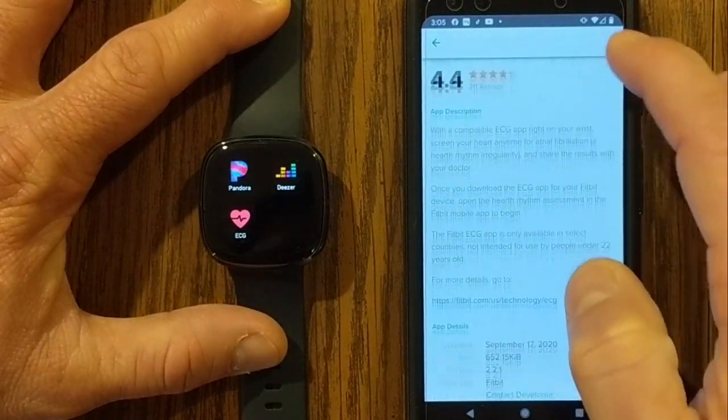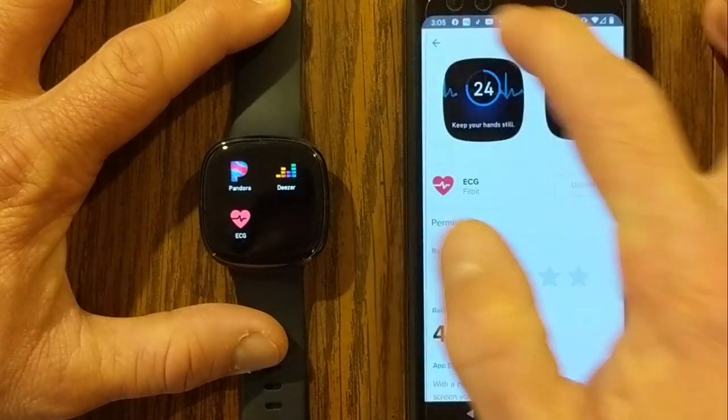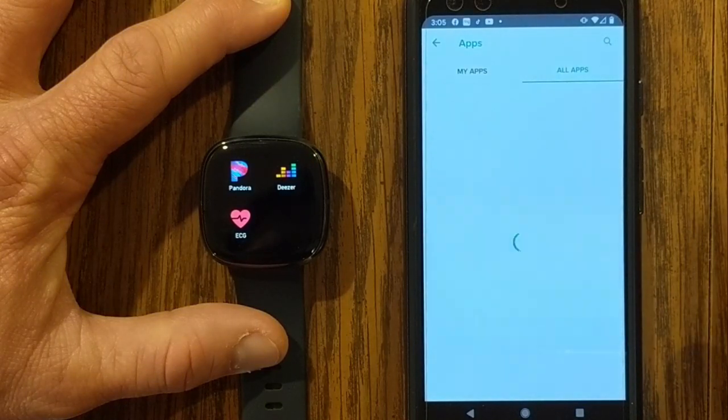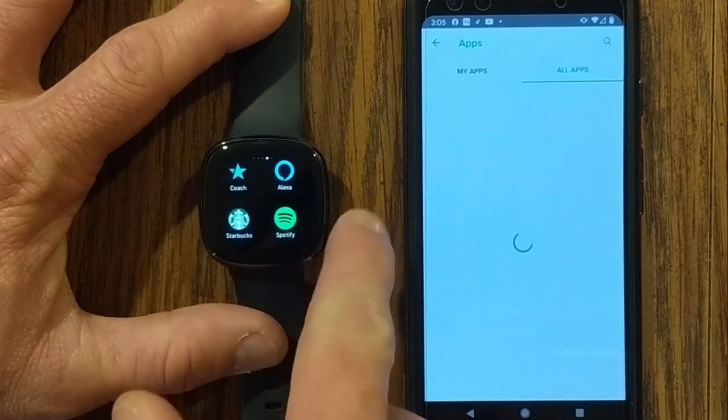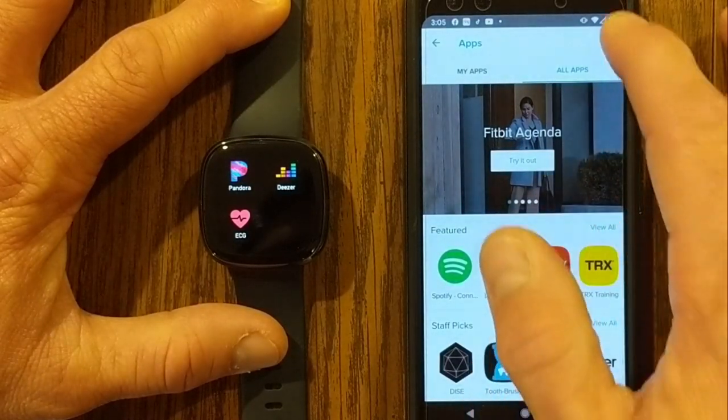I can go into that and read all about it. If I didn't have it, I could install it. If this isn't showing up under your apps, you can go to all apps, then search for the ECG app, and once you search for that, you'll be able to install it.